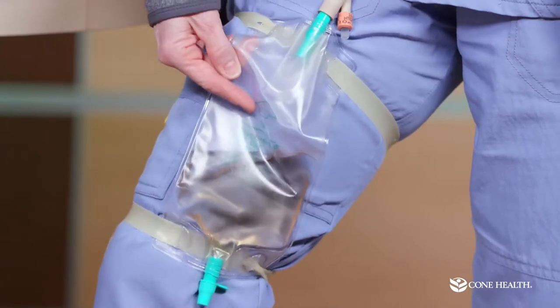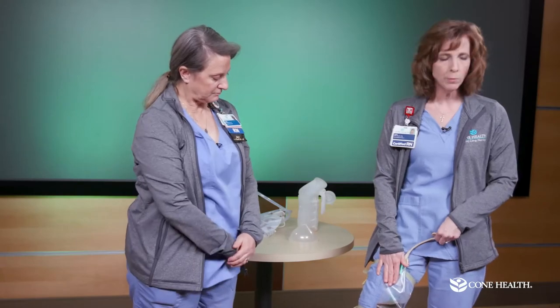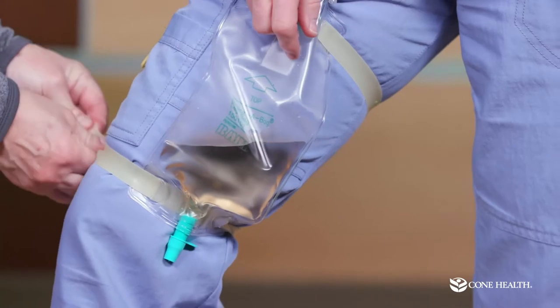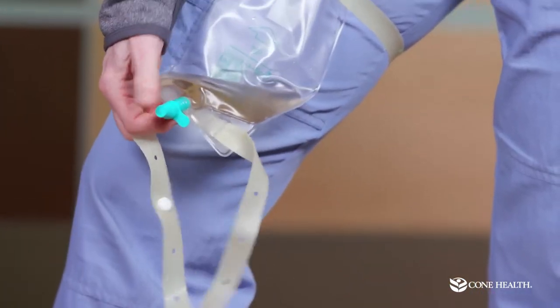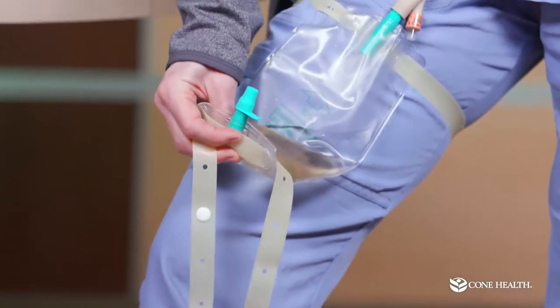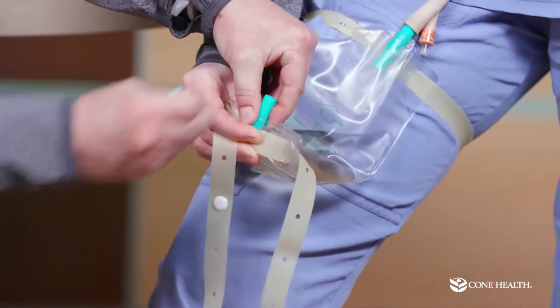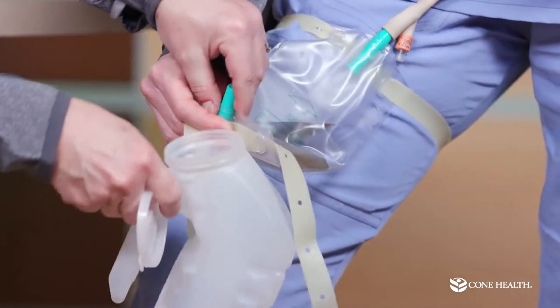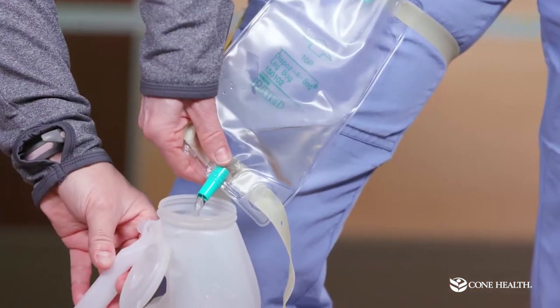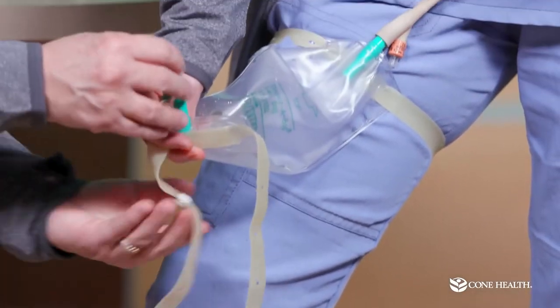To empty the leg bag, unhook the bottom, then tilt the bag up before removing the cap so urine doesn't spill out immediately. Remove the green cap and empty the urine out. Once it's empty, tilt it back up, replace the green cap, and that's all you need to do.